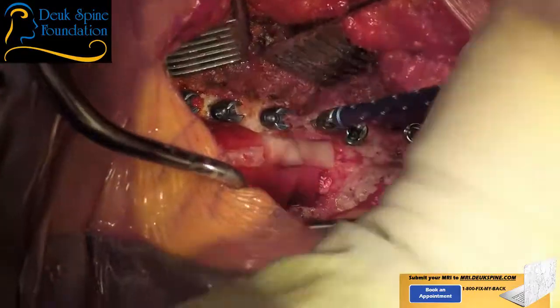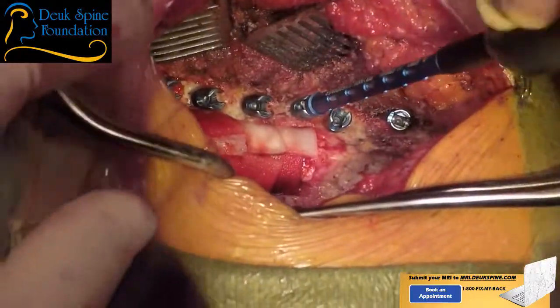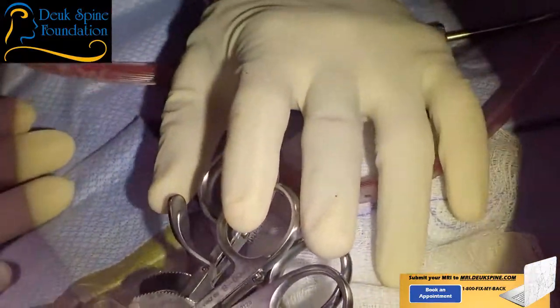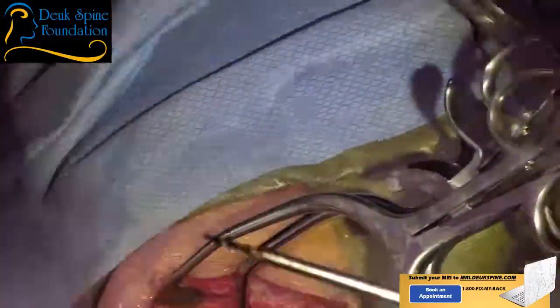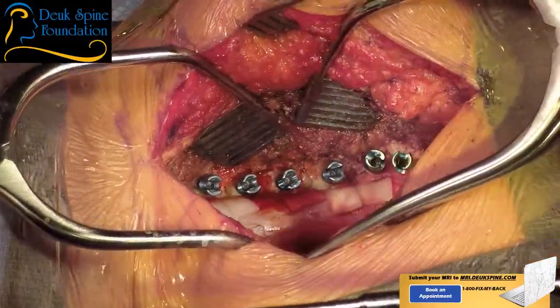And this gets tricky around C7-T1, because a lot of surgeons won't even put a C7 screw in, because they have a hard time getting the rod to go from C7 to T1. But I've done it enough times, I know how to set the heads and the angles perfect so they line up for the rod. All right, so half of our screws are in. Now we're going to put the other half in.